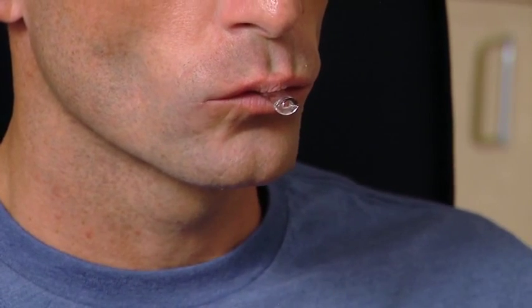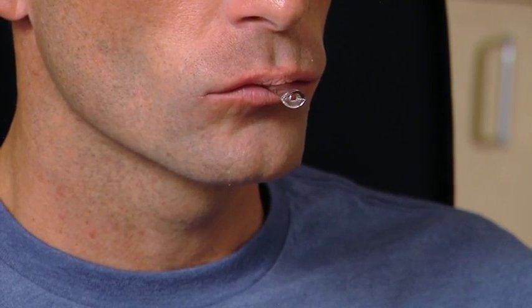After the initial fitting, your trays will continue to cool, shrink a small amount, and become more firm. A somewhat loose fit after the initial fitting is recommended. The tray should fit snugly, but not so tight that they are uncomfortable on the teeth.